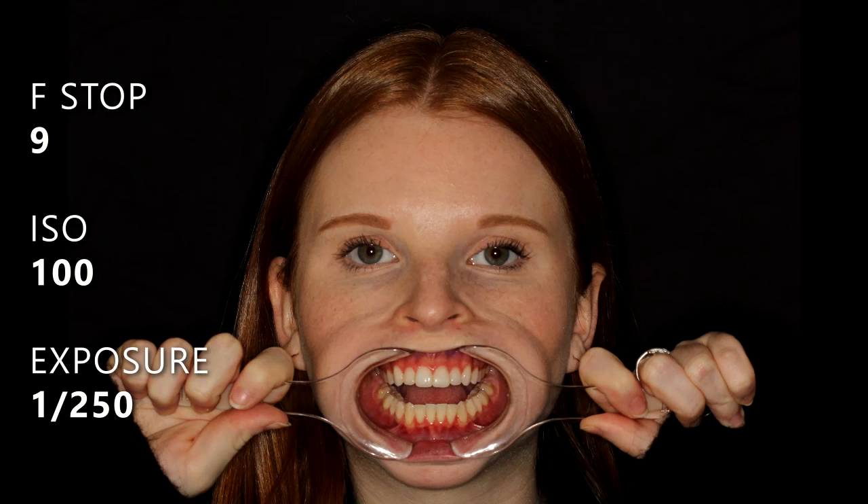I'm going to snap the photo. We take this photo for two reasons. First, when we're doing a digital face bow and aligning the teeth and the face, we can see the occlusal plane and check if there's a cant or a tilt — a lot of times you can't see that when they're just smiling, so having those lips retracted helps quite a bit. It's really important that you have the teeth apart so you can see the incisal edges. Second, when we're taking intraoral scans and melding them with 2D photos and designing smiles, it's really important that you have the incisal edges shown. When you're calibrating the 2D to the 3D you're picking points on both and then overlaying them. If you don't have good reference points the photo and the intraoral scan will not overlay properly and you may not get an alignment.